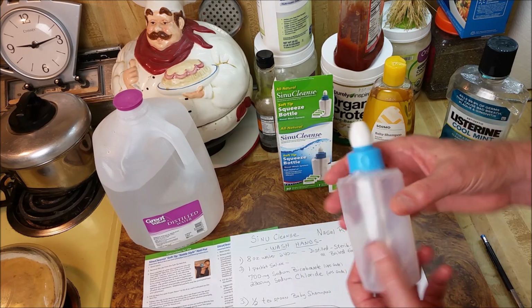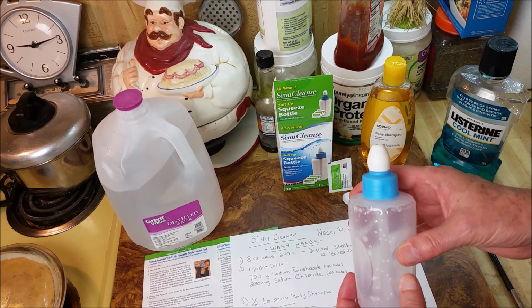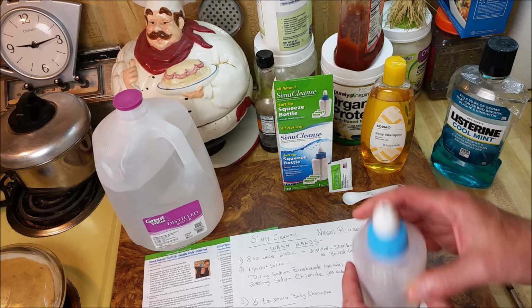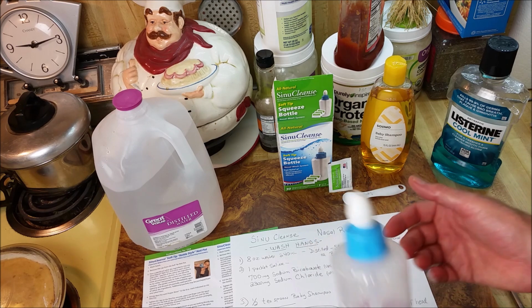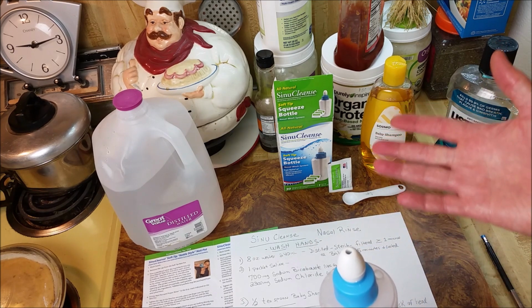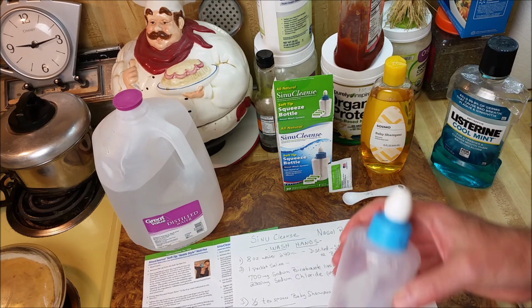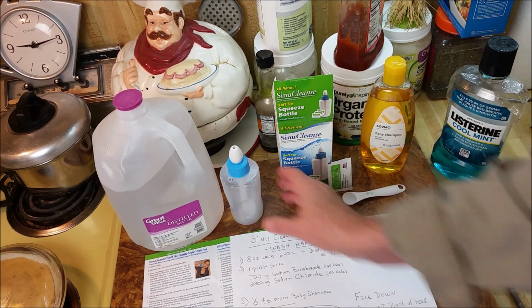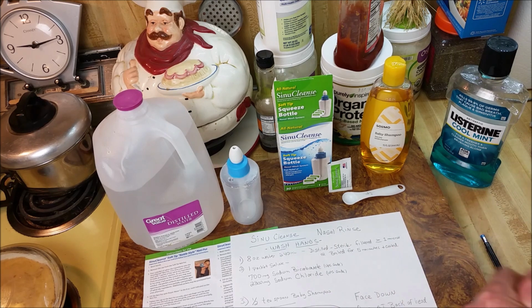Now, I was kind of nervous about doing this because I didn't want a giant stream of water going backwards up my nose into my head. But when I did this, it came out the other nostril, simple as could be. And then I did the other nostril, and then I just tilted my head to one side or the other to help drain, and in 30 seconds it was all over.